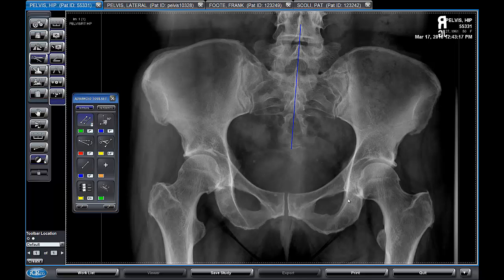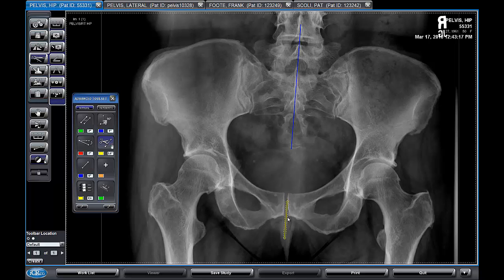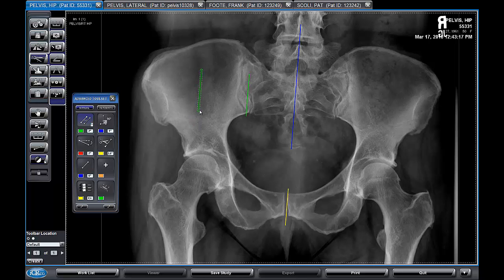We can create a line segment that is collinear to an existing line with the cut line tool. We choose our reference line and drag to place the segment. We can change the length, but it will always remain collinear to where we originally placed it. With the parallel lines, we can change their length and position, but we cannot change their slope — they stay fixed.